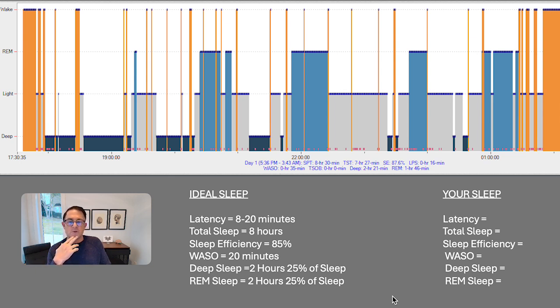And so when we look at the sleep study, you used the machine where we put the stickers on the back of your head and it measured EEG all night long. So it measured this electrical current that keeps you alive. If you've watched the other video about EEG assessment, you know this electrical current goes in different speeds. And so this nighttime sleep study device is able to measure those different speeds and take snapshots every couple seconds of what's going on so that we can map out how much you spent in different stages of sleep.